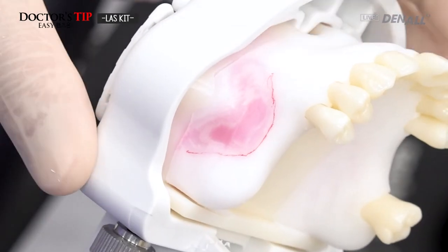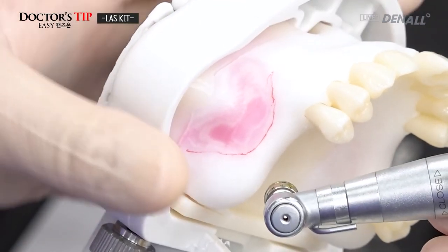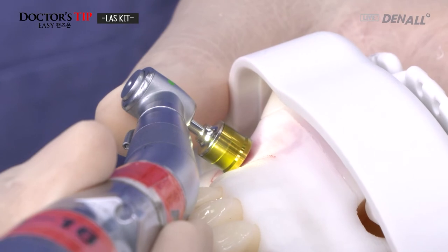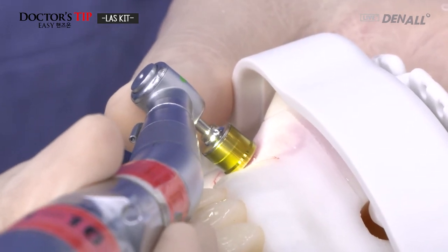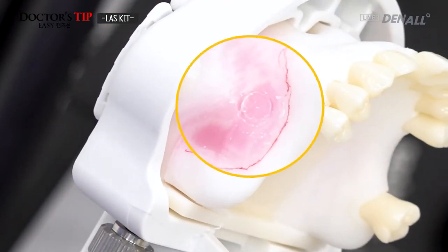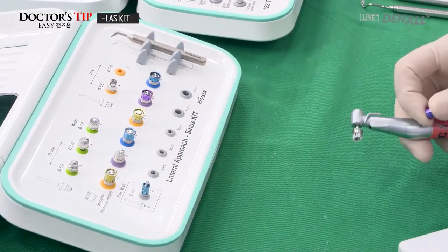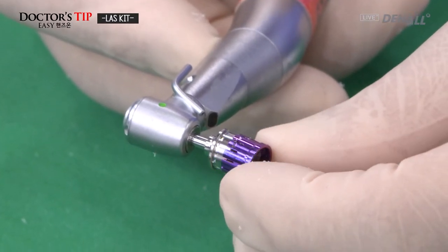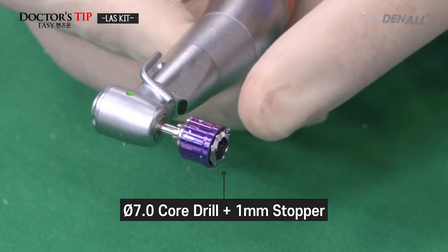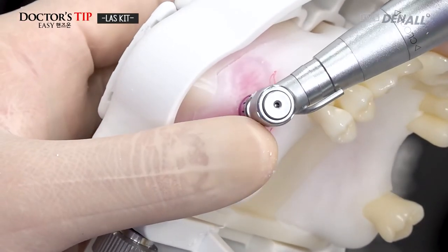And the sinus floor is already formed, so 2-3 millimeters from the front and back side of the floor, we'll go in to form the window. So indentation with 0.5, and yeah, 0.5 is a bit too small, so we will now go with the 1.0 stopper. As you can see, we mounted the stopper on the core drill, then 1 millimeter of the drill is protruding. So again, go in.